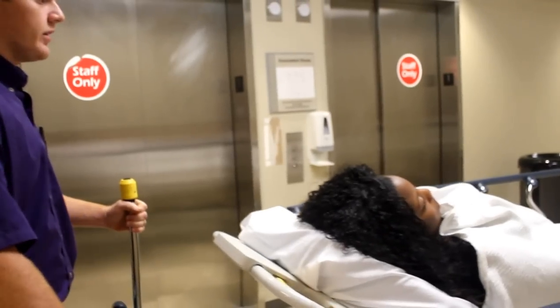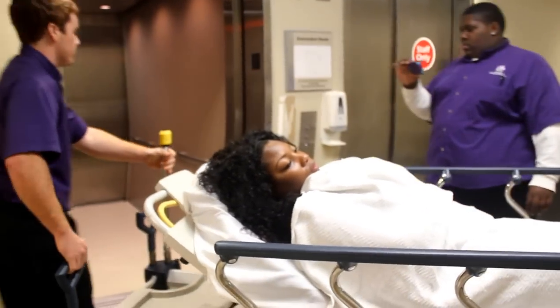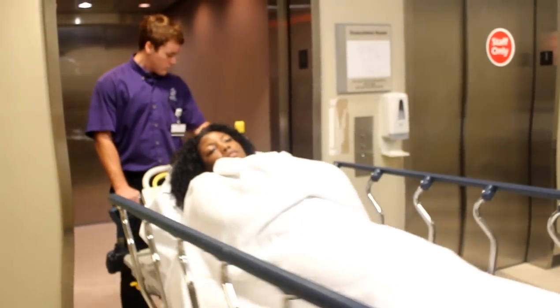We're going to back our patient in head first to the elevator, so that when they come off, their feet will be coming off first.